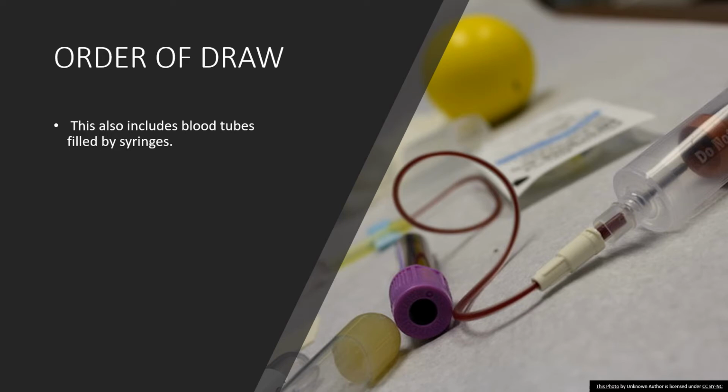But the order of draw needs to be followed whether you're drawing directly out of a patient's vein with a single needle with an evacuated tube system, whether you're using a syringe and a transfer holder to transfer it from the syringe to the tubes, or if you're using a butterfly needle.